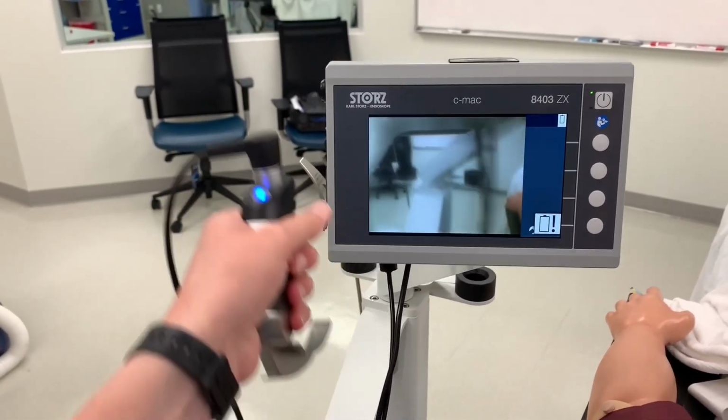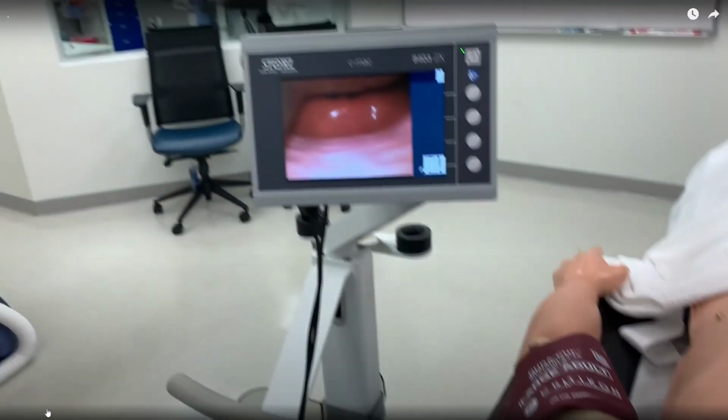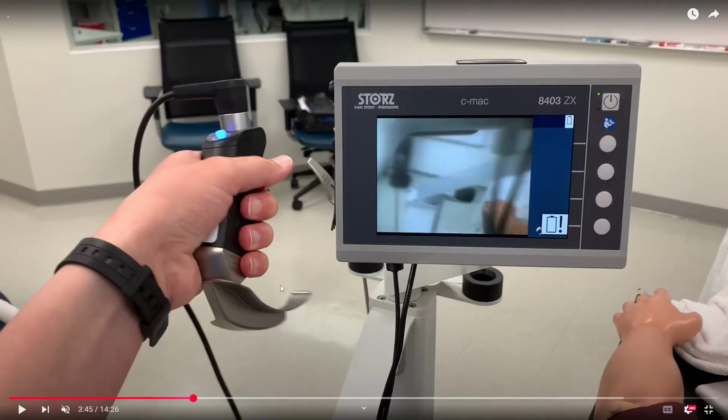Now for video laryngoscopy. So you can see there's a little camera attached to the Mac blade. And I'm filming, important clarification here. Left hand with the blade, right hand on my camera. I have no way to scissor the jaw because I do not have 3 hands. In an actual scenario, you will not be inserting this one-handed, okay? You will be ensuring that the jaw is being scissored open, so you're clearing the teeth and there is no dental damage. It's a very important clarification. Again, in a real patient scenario, this would not happen.